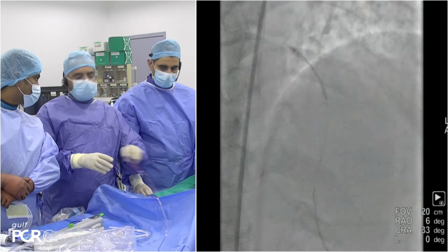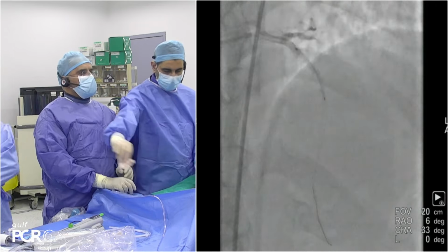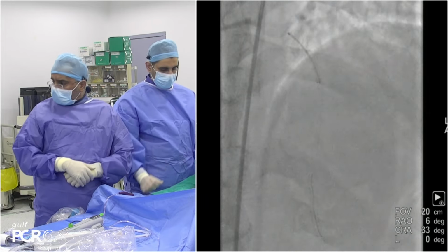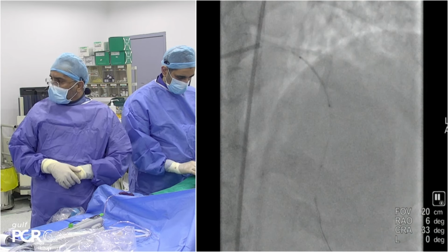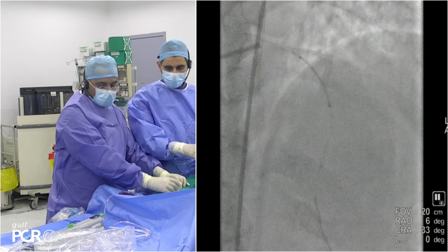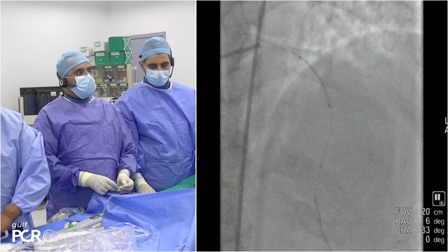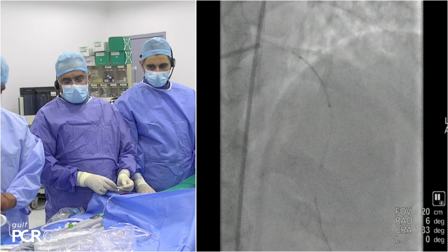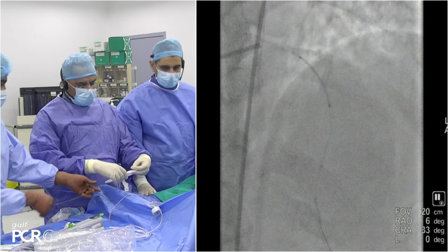Question, comment? No. Thank you so much. Just a small comment about imaging. The value of repeating imaging immediately after the calcium modification with rotablation gives you more room for re-ablating with the same device before doing a balloon, which induces dissections and makes you much more worried about re-ablation technology, either rota in a dissecting segment. So I personally prefer to do imaging immediately after rotablation or atherectomy to see if I need more ablation runs before going for balloon-based technology.